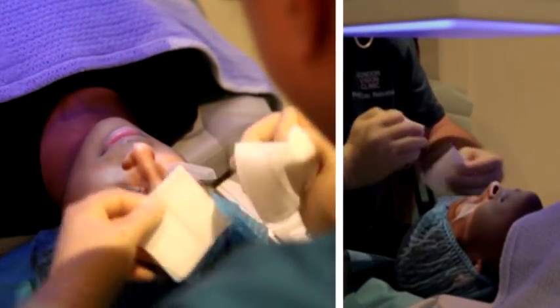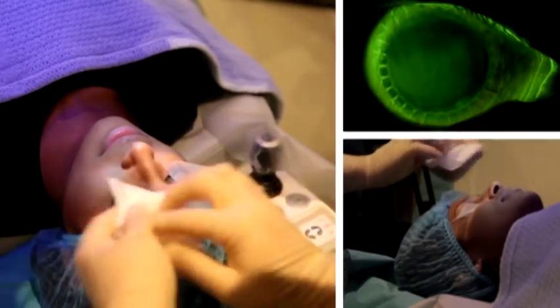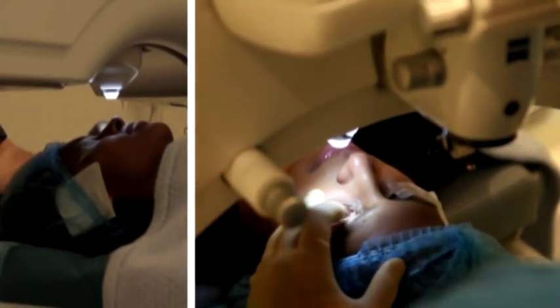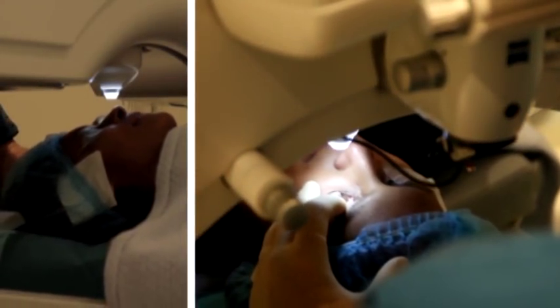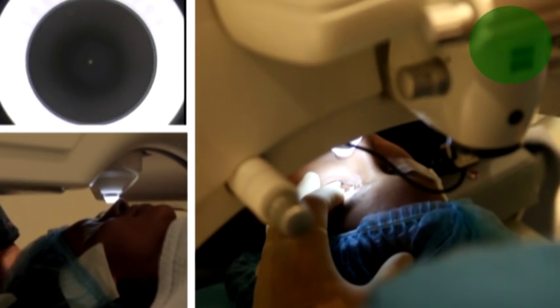During SMILE, there is minimal to no discomfort for the patient. After the speculum is placed, the patient is asked to fixate on the green light that is focused according to his refraction.